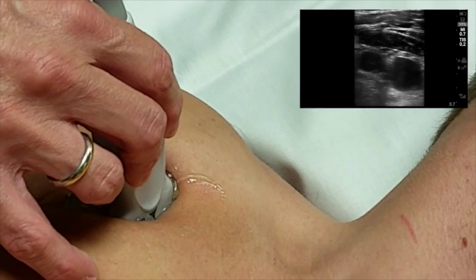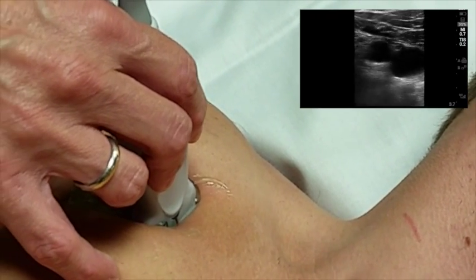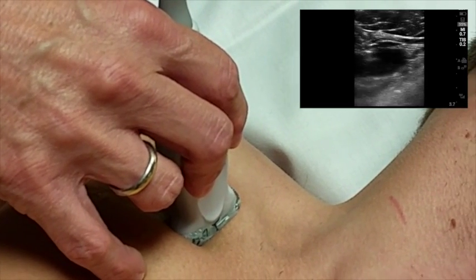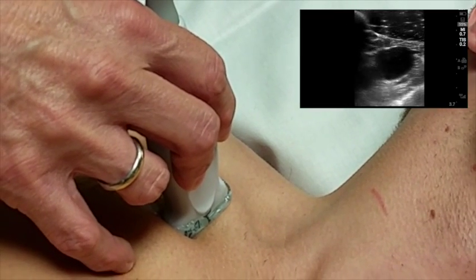Begin tracking the vein medially as it begins heading superior and finally goes beneath the clavicle, which will be very superficial and have the typical shadowing of bone.